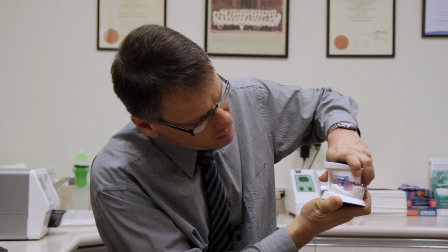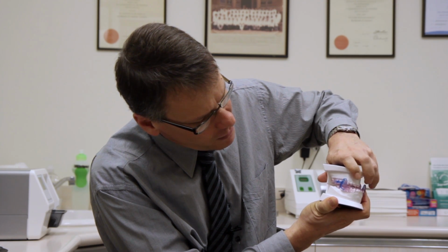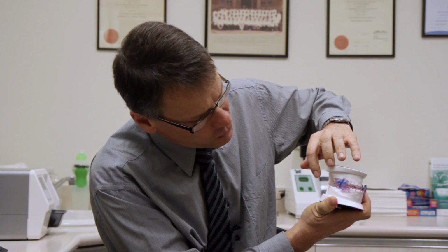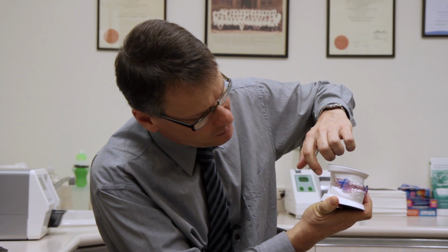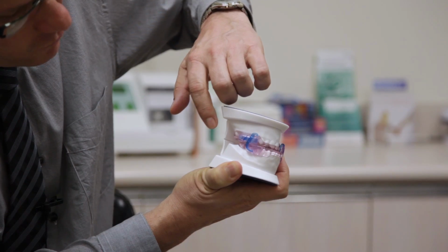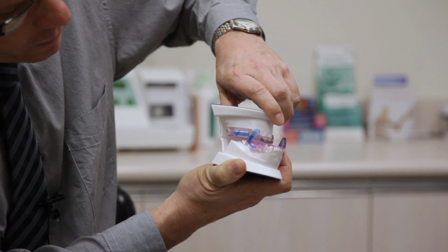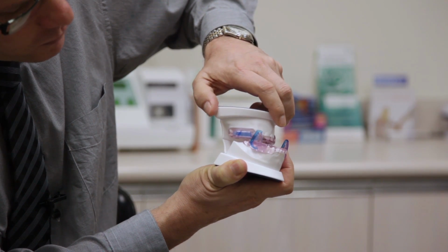Now we do have to be a little bit careful, because we don't want to push the jaw too far forward. The joint over here, the temporomandibular joint, which enables a person to open and close and move sideways, if we stress that joint too much by moving the lower jaw too far forward, we're going to cause damage here.